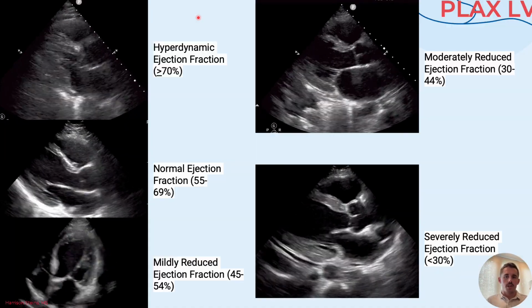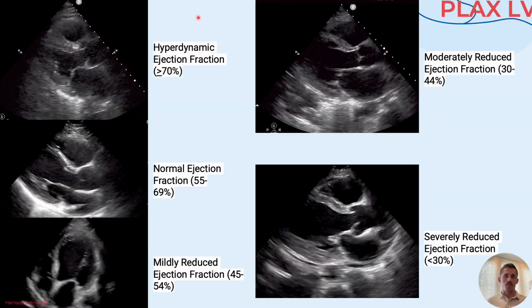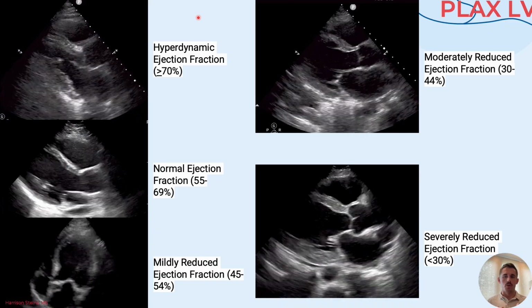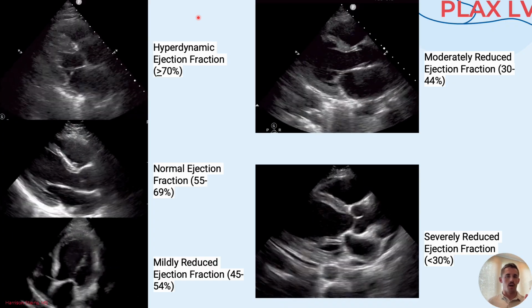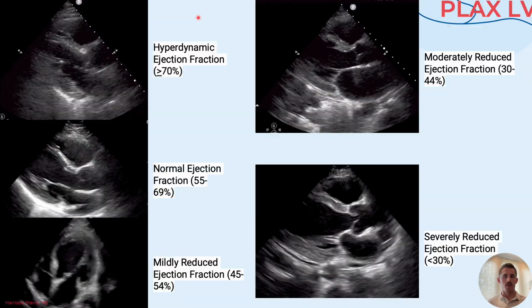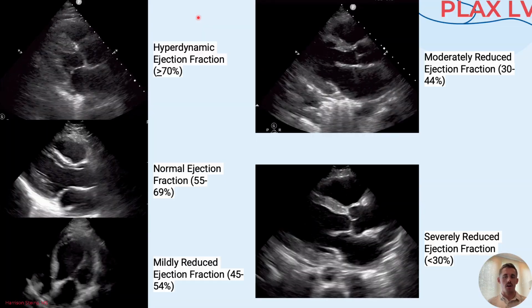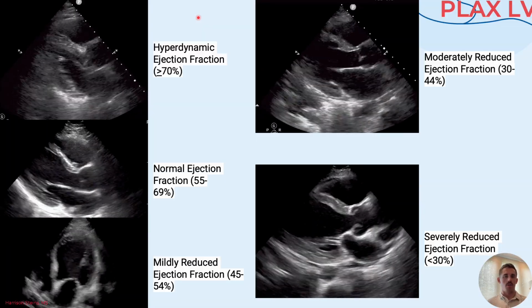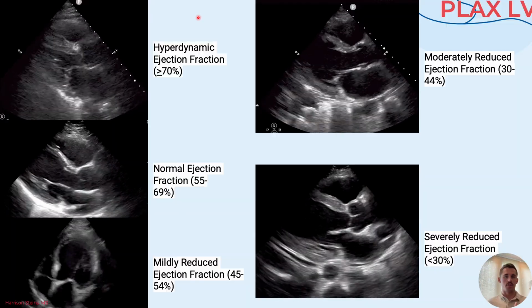So we're visually assessing the basal and mid-ventricular and septal portions, right? We're observing how well the walls are pulling in from the left ventricle. Are the walls pulling in evenly from the external part of the left ventricle to the interventricular septum? Are they pulling in too much, not enough? And then we're observing the mitral valve. How well are the valve cusps co-opting, and how well are they slapping against the interventricular septum and the septal wall?